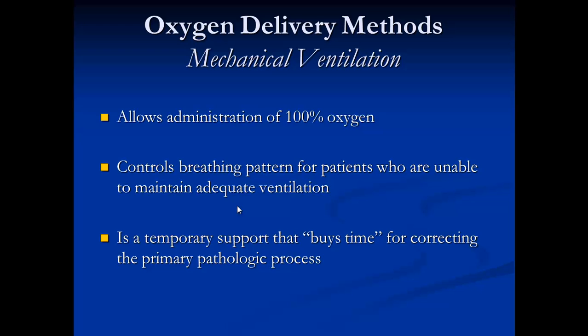When the patient initiates the breath, it is called an assisted breath, and a triggering signal results when the patient's inspiratory effort produces a drop in air pressure. In the absence of patient interaction with the ventilator, breaths are delivered based on elapsed time. This is called an unassisted or mandatory breath.